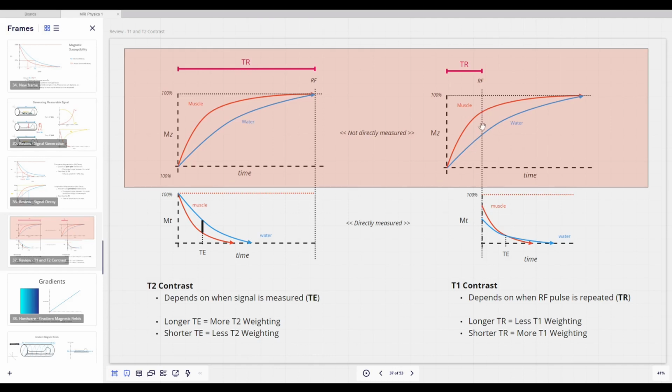Okay, and it's that difference here that actually gets encoded in the start positions in the transverse magnetization curves. And so practically speaking, the curves as you go over time are going to look different than if you had given everything enough time to fully recover. These curves look different, even though the TE is the same. You're measuring at the same time, but what we've done here is we've adjusted the TR.